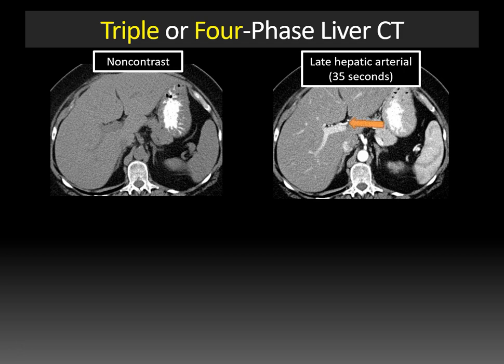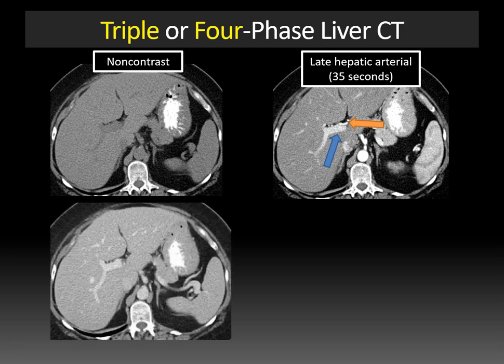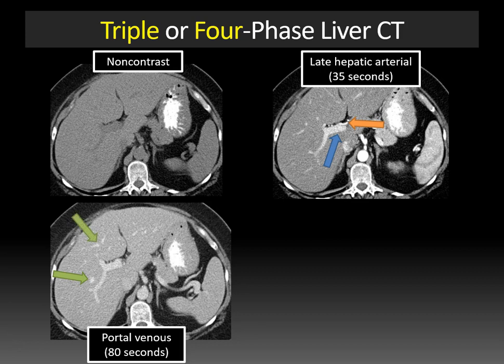During the late hepatic arterial phase, you'll see the hepatic artery enhancing — denoted by the orange arrow — and the portal vein, shown by the blue arrow, should be homogeneously enhancing. After that, we have the portal venous phase, which occurs at about 75 to 80 seconds after contrast injection. You'll still see portal vein enhancement, but then hepatic vein enhancement begins, and the parenchyma demonstrates more robust enhancement.